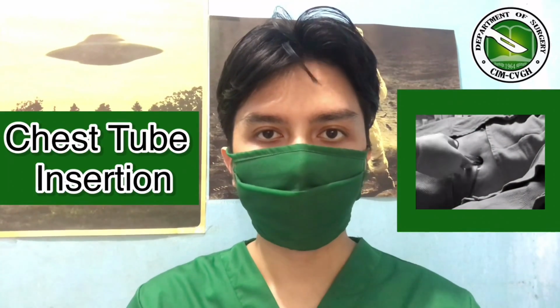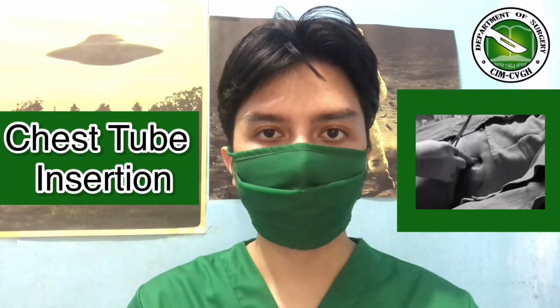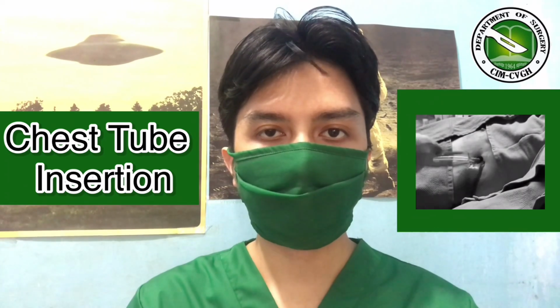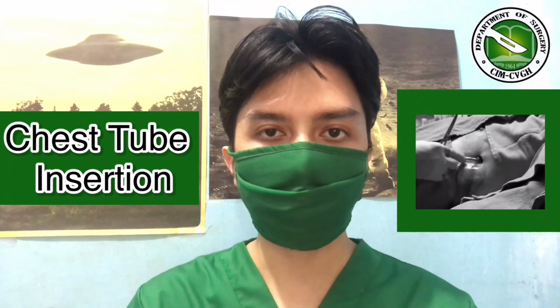Hi, I'm Janjimal Espejo, a medical intern from Cebu Institute of Medicine. Today I'm gonna demonstrate a basic surgical skill, which is chest tube insertion.